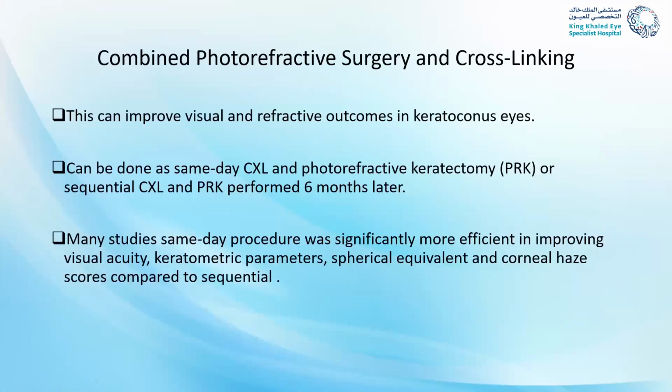So the cross-linking plus is basically when you do cross-linking plus photorefractive surgery or PTK. And the whole aim in this procedure in keratoconus eyes is just to improve the higher order aberrations, just to regularize the cornea and improve some of the refractive outcomes in these keratoconic eyes.